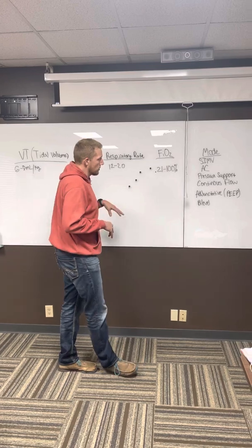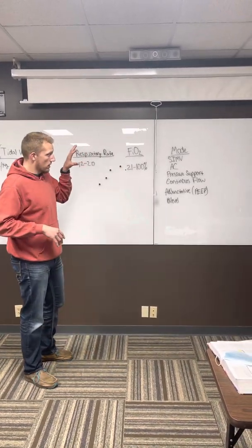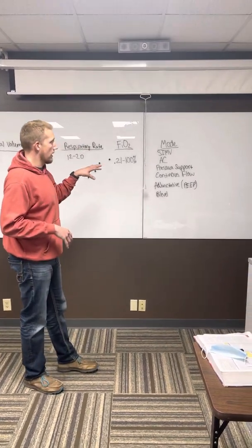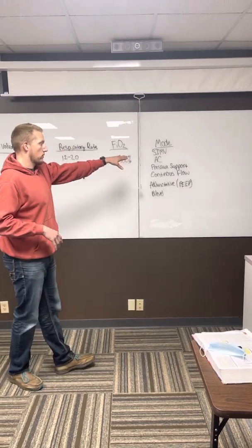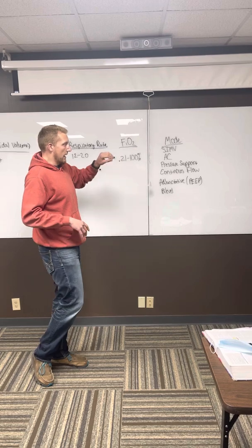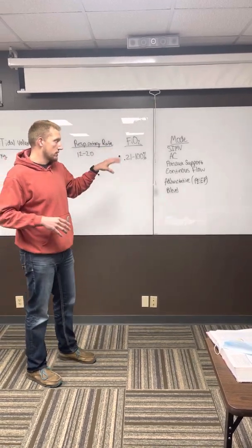And then we go into our modes, which I know another group is going to go over more in depth, but we have our synchronized intermittent mandatory ventilation, which is predominantly used to wean. So if we want to wean a patient off a vent, we would use that.